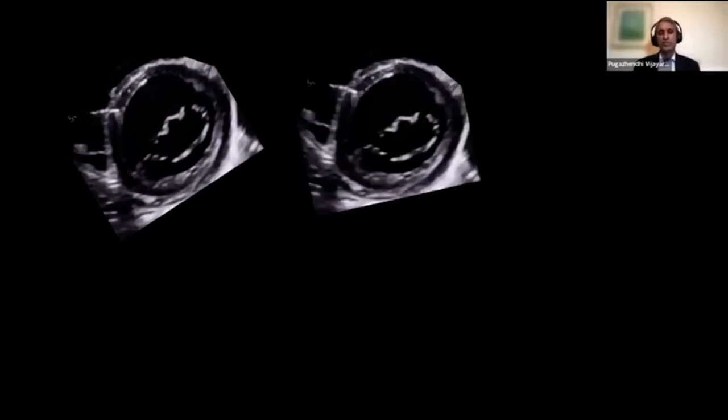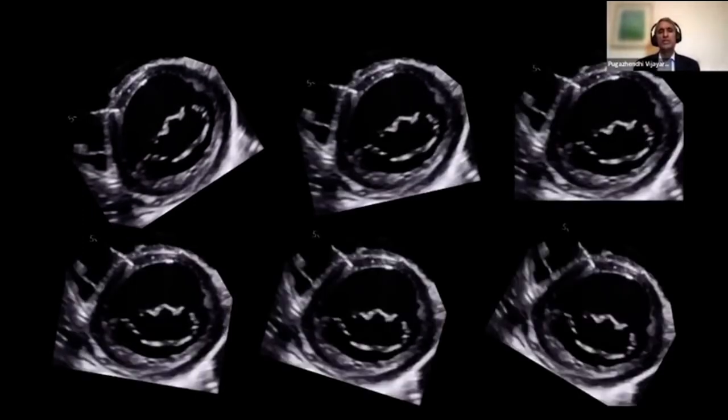And when I talk about orientation of the sheath to the septum, I've just twisted this in multiple angles. So imagine this is the normal interventricular septum. The RV is on this side. And in some patients, the RV is quite anterior, like this, rotated around. And when trying to get the sheath oriented perpendicular, the landmarks I showed you, 12 to 1 o'clock in RAO and 2 to 3 o'clock in LAO, may not apply in a patient that is fairly rotated.